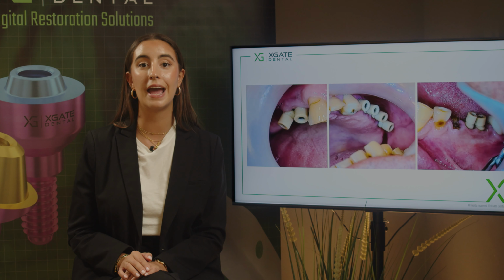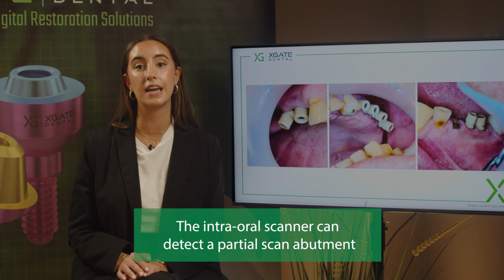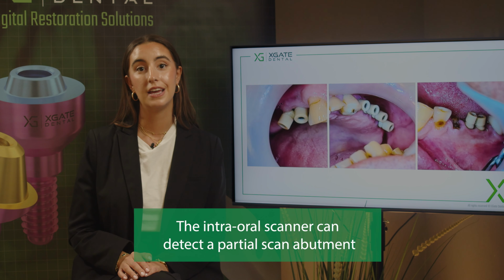Still in the program in CAD, this is how you shape the modeling program. You can use this scan abutment. It will work absolutely fine. And even with the scan abutment that are made from metal or anything else, it's totally fine. It's not an issue. You can take out part of the scan abutment, and you need to always remember that it's one of the options that you have.